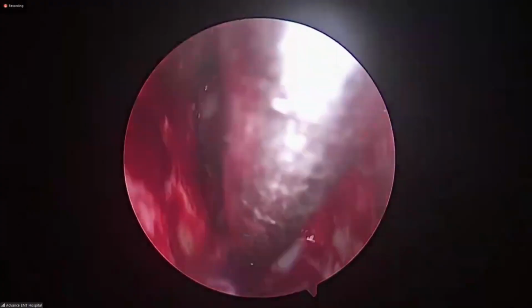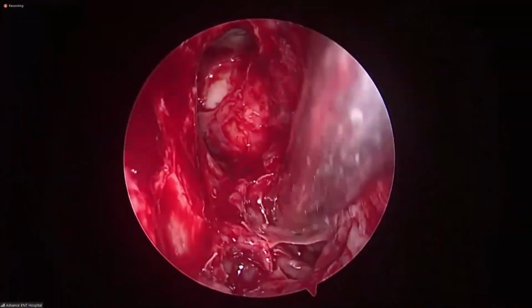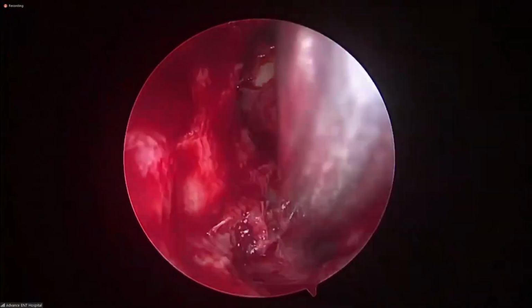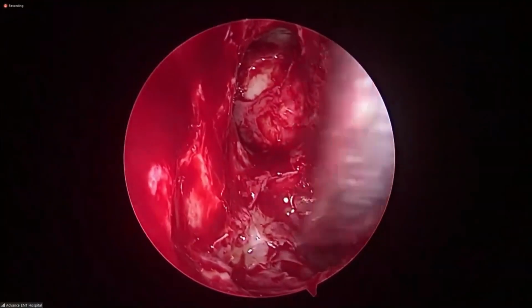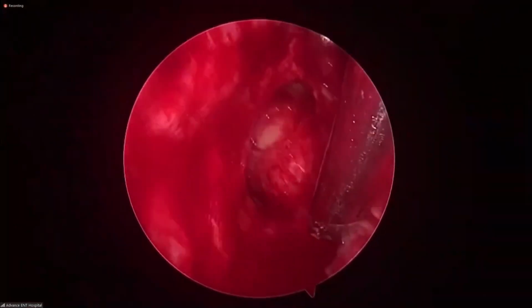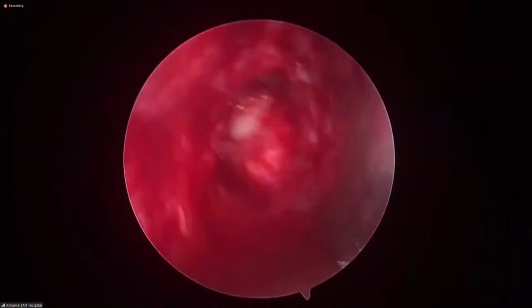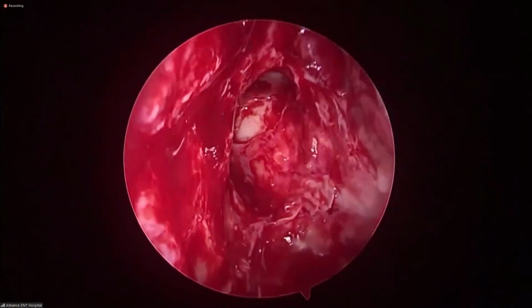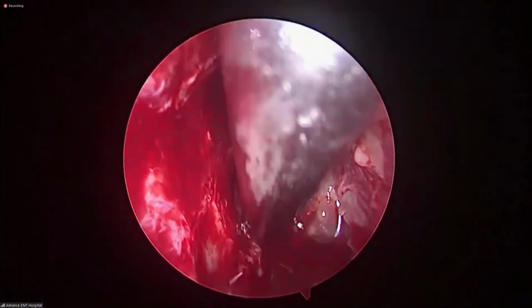Now the reverse, same. Yes, sir. And flushing with the skull base. Sphenoidal skull base. Yes, sir. With the reverse blade. Yes, sir. Is that the artery, sir? This is no.